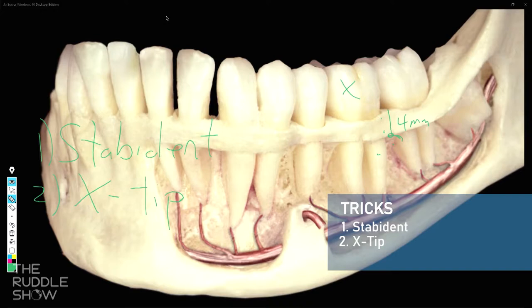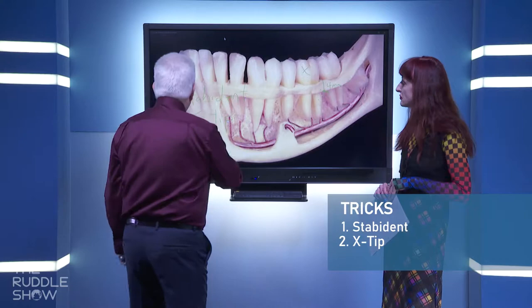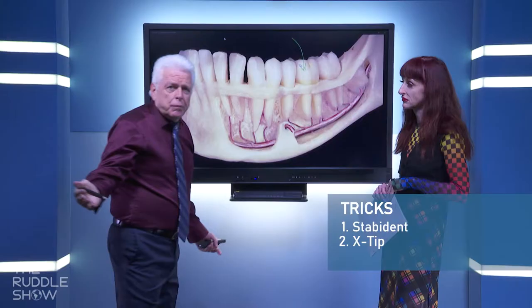And that sleeve is where you put your anesthetic needle to deposit a few drops in the bone. Go slow. Don't put a lot in. You can cause damage, just small infiltration. Look, you're just trying to buy a little time. You're not trying to have profound anesthesia for an hour and a half. You're just trying to get into the pulp chamber on your access. Once you get in here, you can give an intrapulpal, but you've got to get in without the patient hopping around the chair.